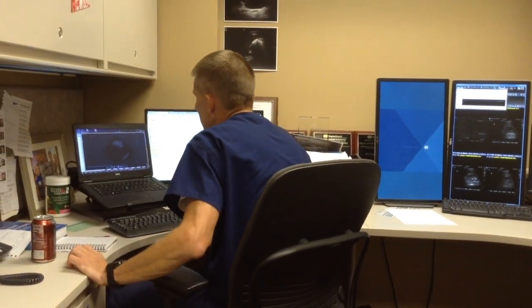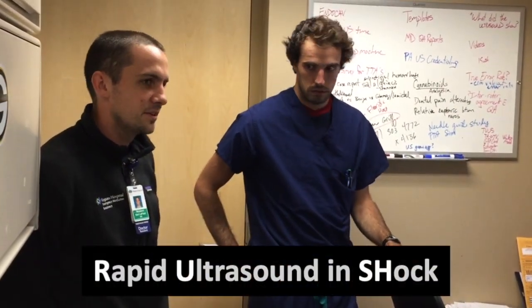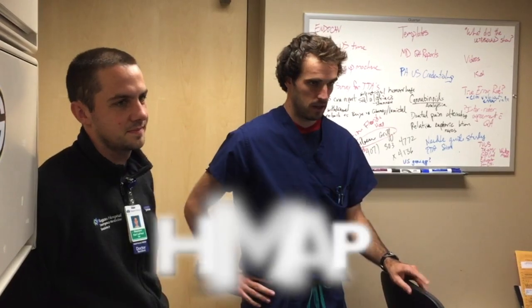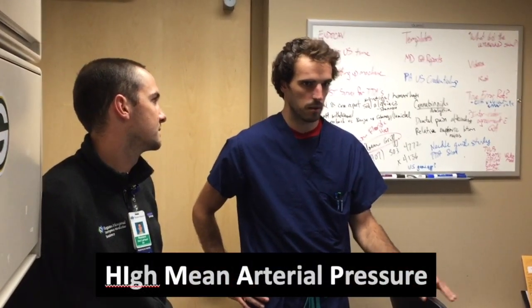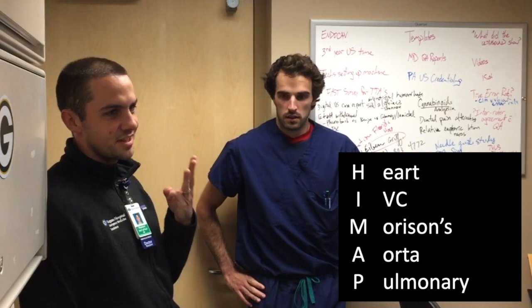Come on in, good to have you guys on the rotation. Let me see if you did your reading. Tell me about the RUSH exam — what does it stand for? Rapid Ultrasound in Shock. And what mnemonic do I prefer? HI-MAP, because it tells you about your goals for the patient — to raise their MAP — and each letter stands for something. The letters are Heart, IVC, Morrison's, Aorta, and Pulmonary or Pneumothorax.